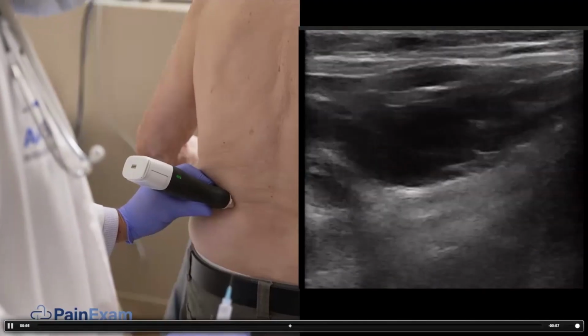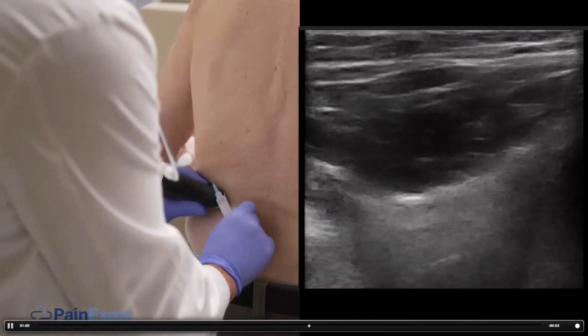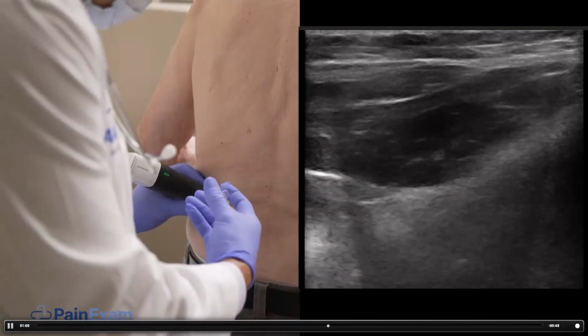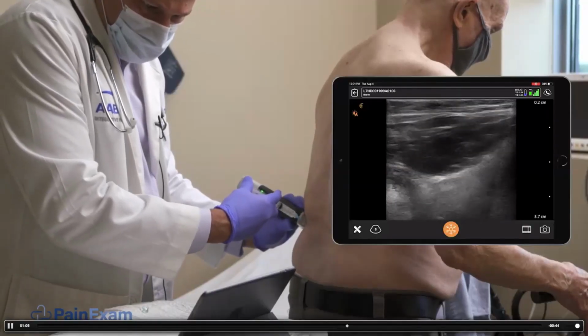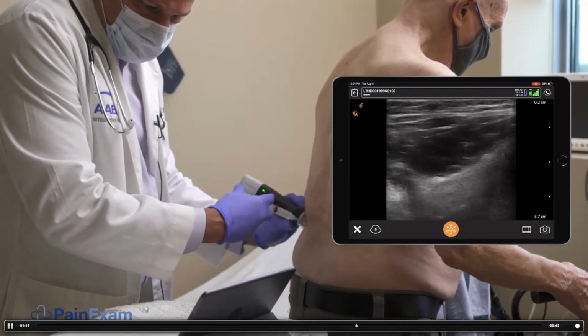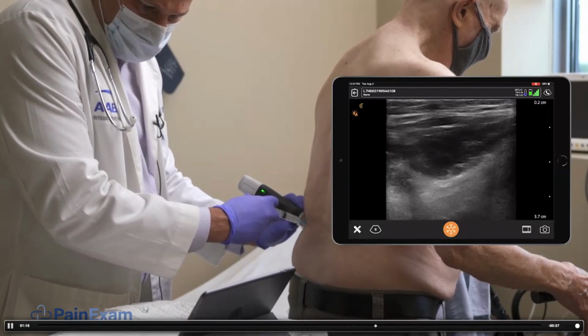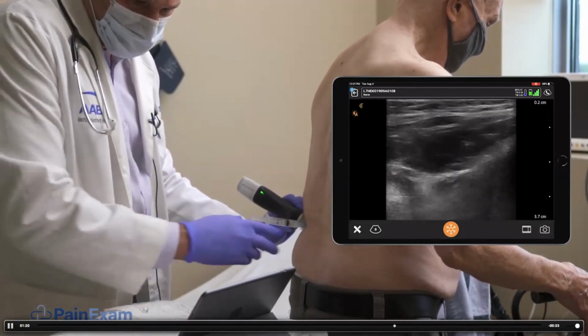These nerves pass through a fibro-osseous tunnel as they cross over the iliac crest and descend. A little pinch. Is that the spot? I think so.